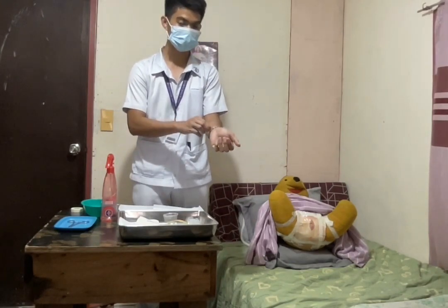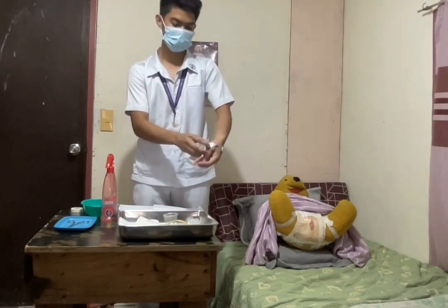Then now open the set, observing the sterile technique. As you can see, I have opened it already. This prepares additional sterile supplies while maintaining aseptic conditions. Next, I'm going to put on the sterile gloves. This is to maintain a sterile field and prevent contamination during the procedure. First, before I put on my sterile gloves, I'm going to take off my wristwatch.